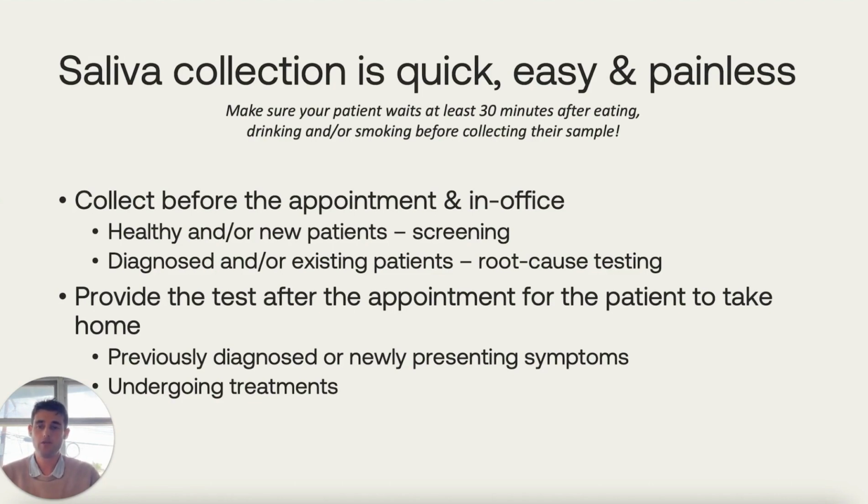The first option for sample collection is before the appointment and in office. In this case, the patient would arrive for their appointment and they would immediately be given a saliva collection tube by potentially the front office staff or a hygienist who's on duty.